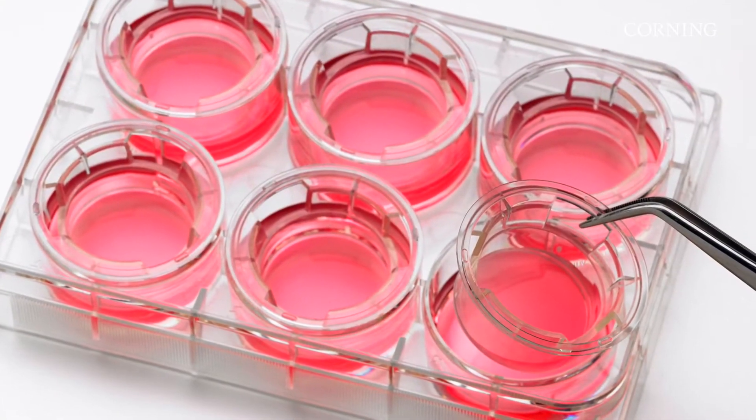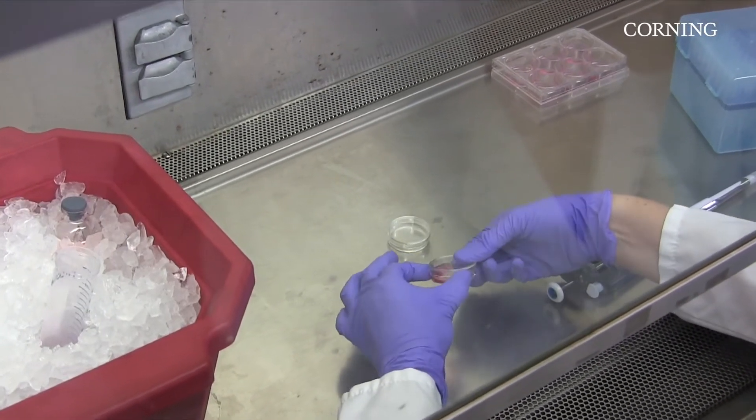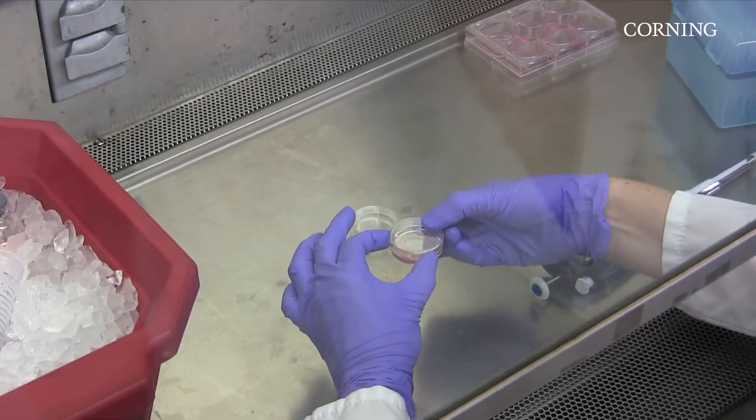Cells may also be cultured inside Matrigel Matrix using a 1 mm layer. This thick coating method is a good option for cells that you wish to grow in a 3D matrix.